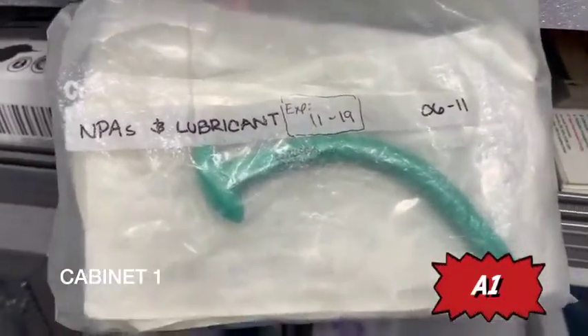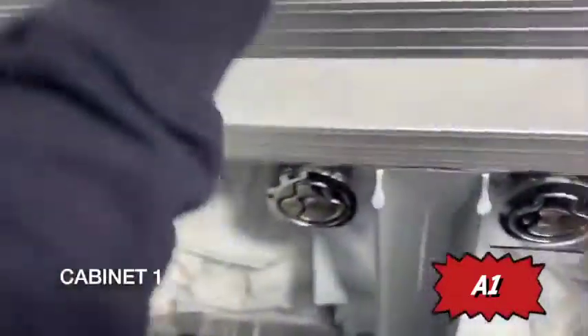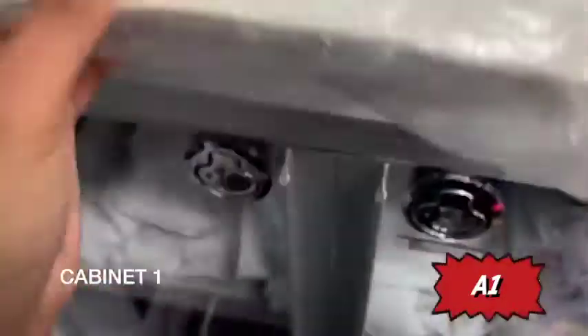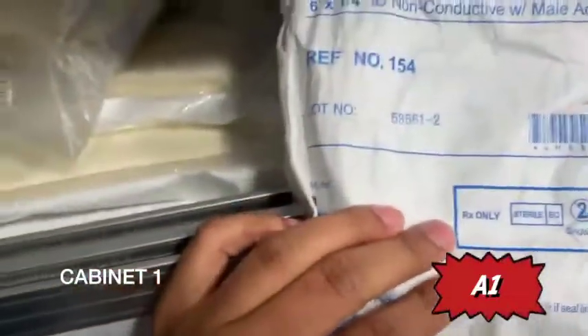And you have an NPA. Moving downwards, you have your rigid suction tips, your trauma dressing, and your French suction catheters. You have your OPAs and your suction connecting tube. That pretty much covers cabinet one.